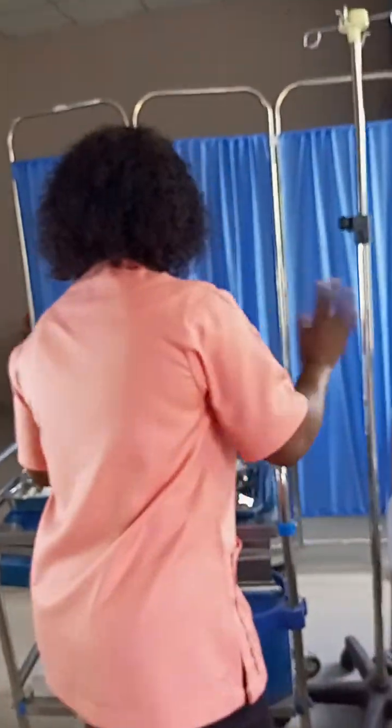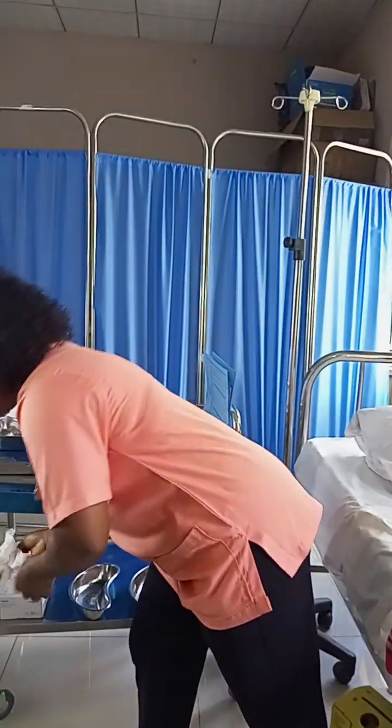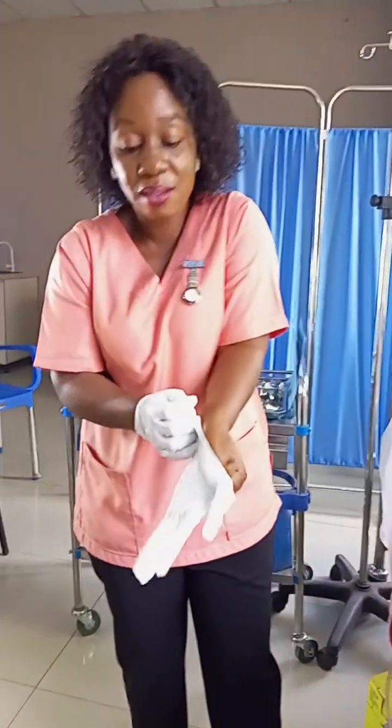So now I'm going to perform hand hygiene. Remember, it is important for you to perform hand hygiene. So, let's go perform hand hygiene. I have performed hand hygiene and dried my hands. The next thing in this procedure is for you to don your gloves. Remember, this is not a sterile procedure. It's a clean procedure. So protect yourself as a nurse. Don your gloves.